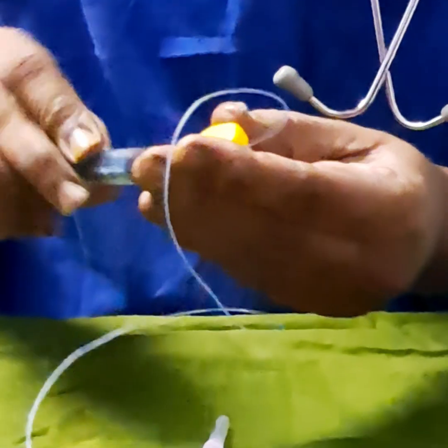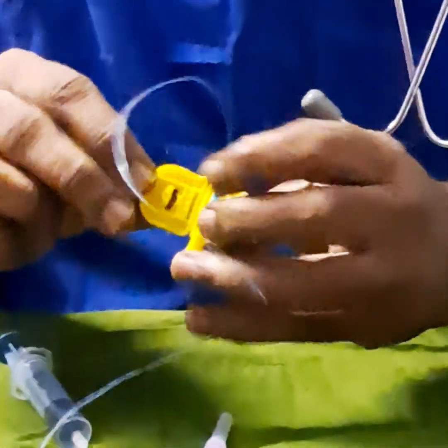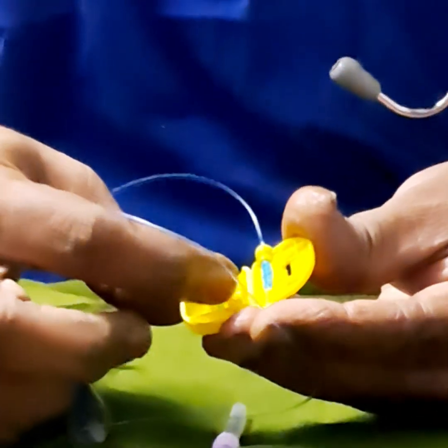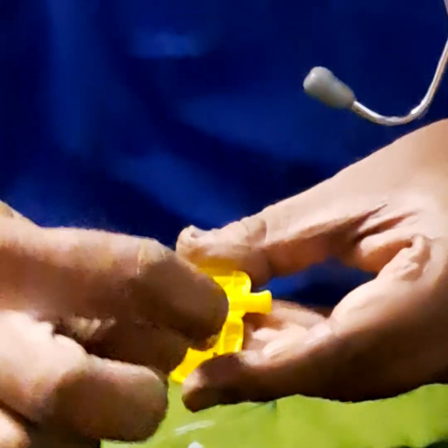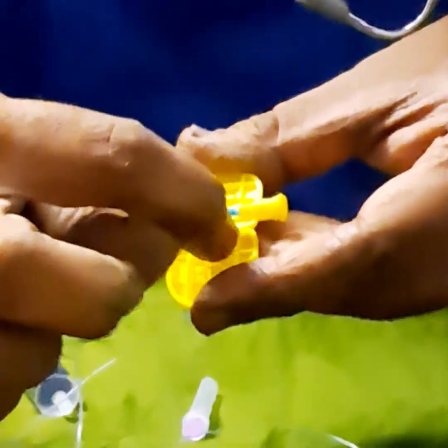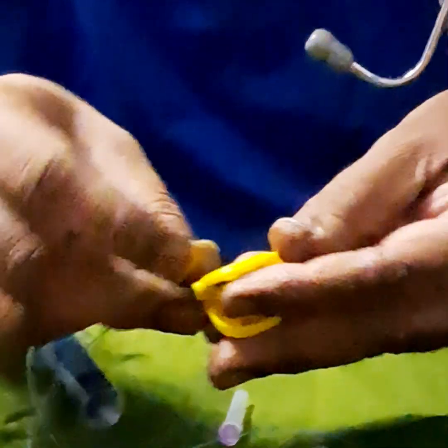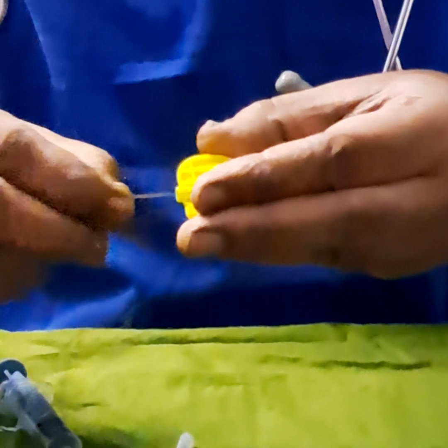Now, again, I am telling you — you open this. There are 4 ridges here and 3 holes here. This will get compressed. The ridge will go into the gap here — you can see the gaps — and compress the silicone, so that the catheter doesn't come out.